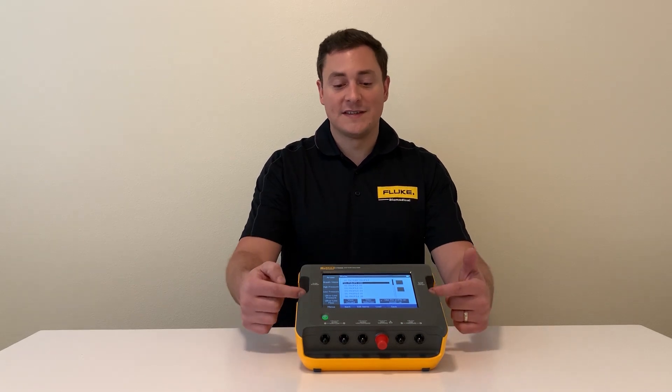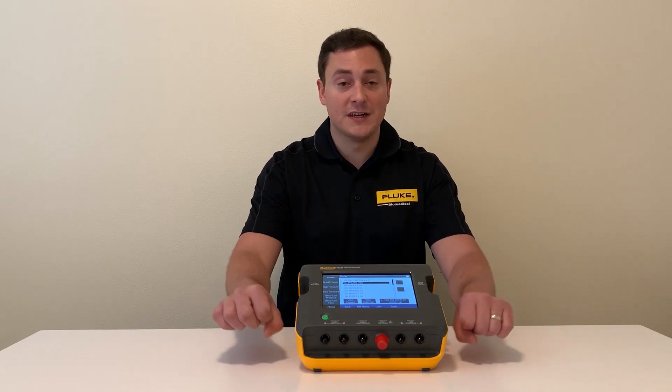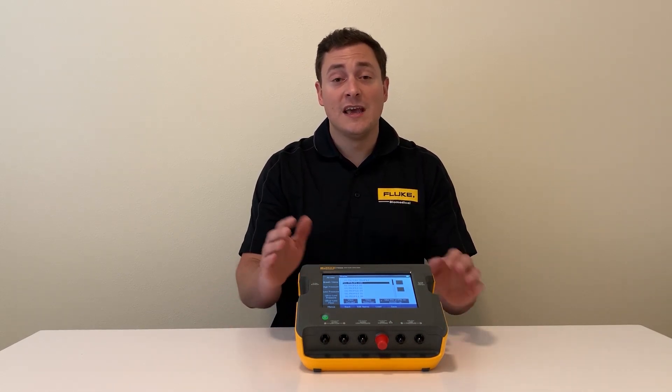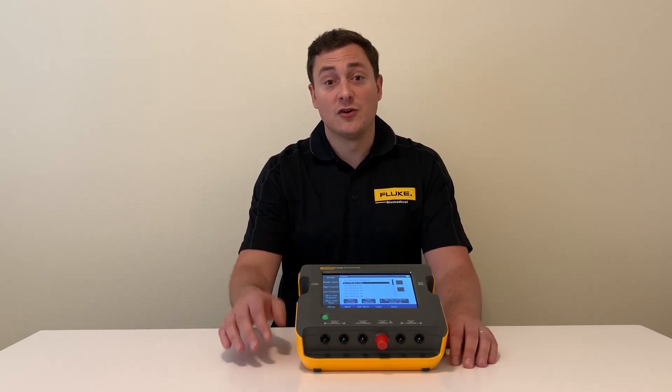The unit also has a single flow channel that handles both high and low flow, so there's no need for multiple connections or multiple modules. It's all built into the unit, and it automatically compensates for temperature, humidity, and pressure so that you don't have to.